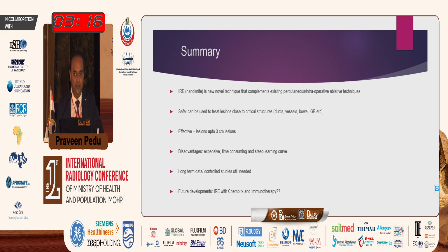Disadvantages are it's expensive compared to microwave because it involves multiple needles, and there is a learning curve with that which is often very steep. So you need to get familiar with the technique and needle placement in order to achieve the results you want. We still do not have any long-term randomized trials, but we have lots of observational and retrospective studies which demonstrate good efficacy and safety, which is comparable to microwave or radiofrequency ablation.